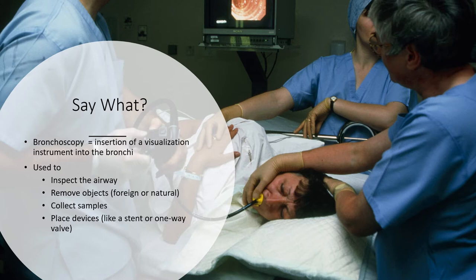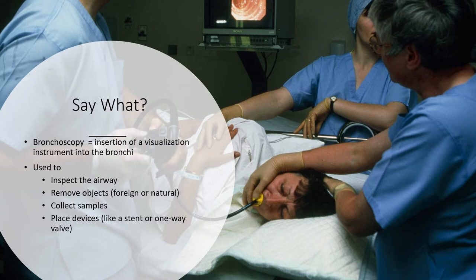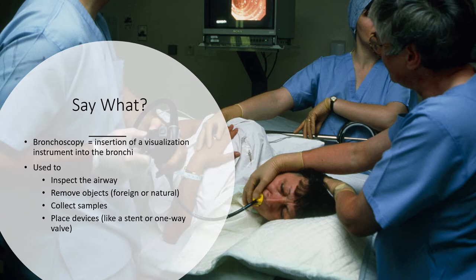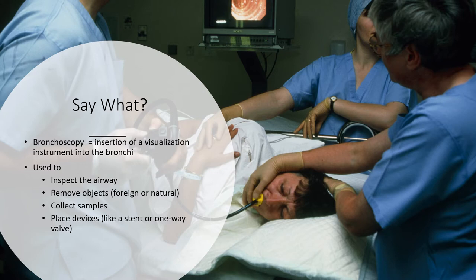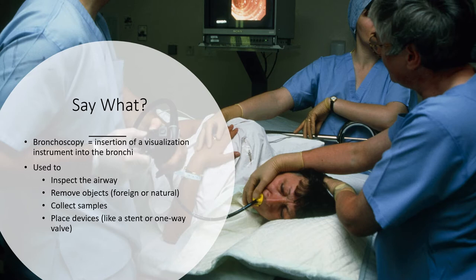Removing objects — either foreign objects or natural objects — is another indication. Natural objects could be like tissues or tumors growing into the airway. Or it could be a natural thing like someone who aspirated a peanut, or a foreign body like a piece of Lego or a nightlight. You will see a whole bunch of different things. Removing foreign or natural objects is definitely a therapeutic indication.